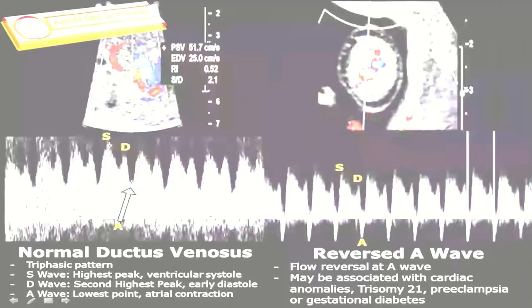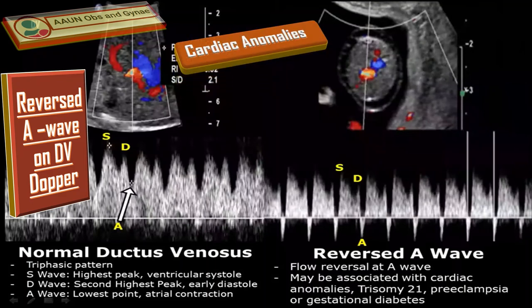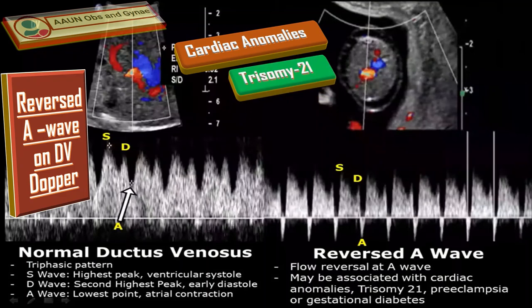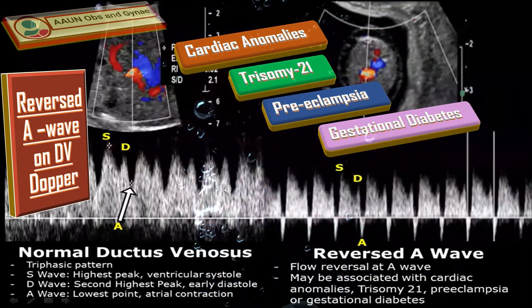Here is another example of a reversed A wave on Doppler ultrasound. The A wave is below the baseline, indicating flow reversal. This finding may be associated with certain conditions like cardiac abnormalities, trisomy 21 (also called Down syndrome), preeclampsia, and gestational diabetes. That was all about the ductus venosus Doppler — thank you so much.